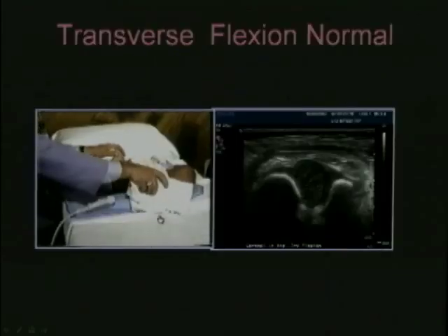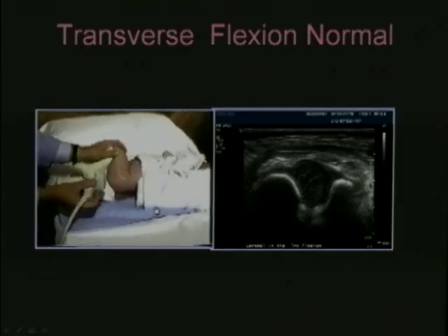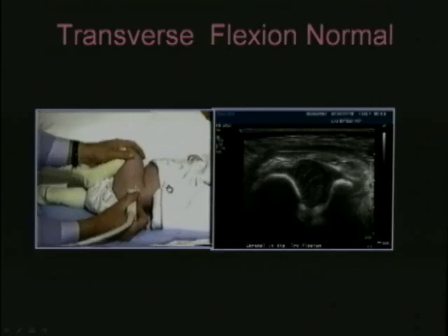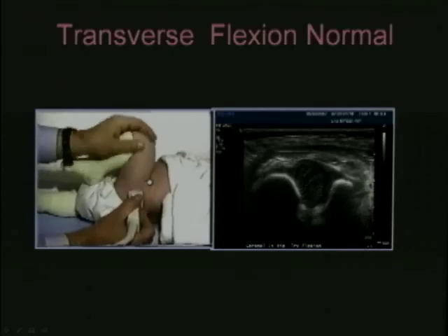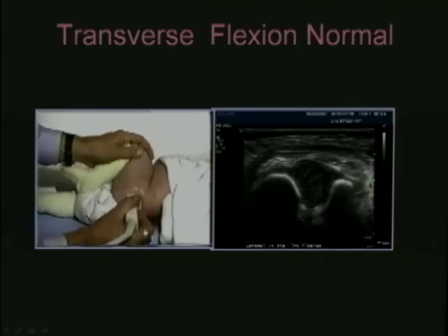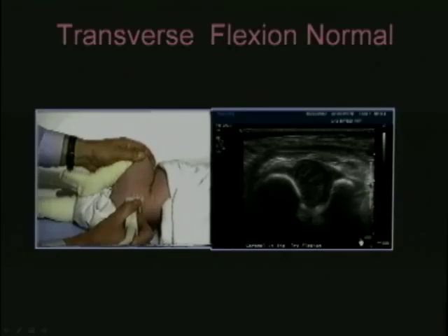In doing this particular transverse flexion view, we see the baby has been turned a little bit to the right, and we're scanning perpendicular. This is the Ortolani as Dr. Harkey comes out with external rotation and abduction, and this is the Barlow maneuver, a gentle maneuver with the knee adducted medially with this pistoning posteriorly, and this is what it looks like on the ultrasound.